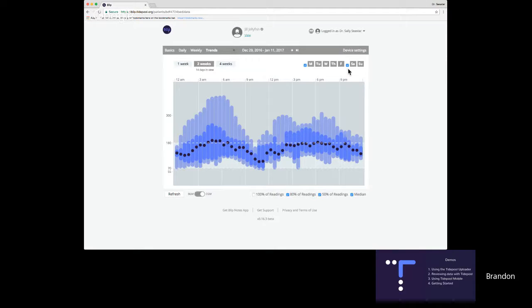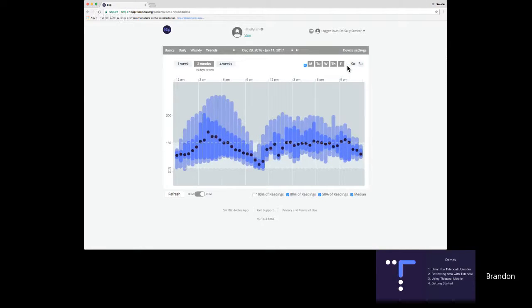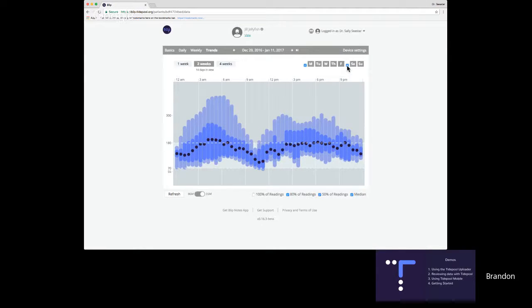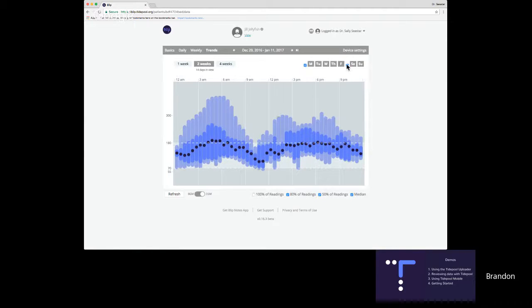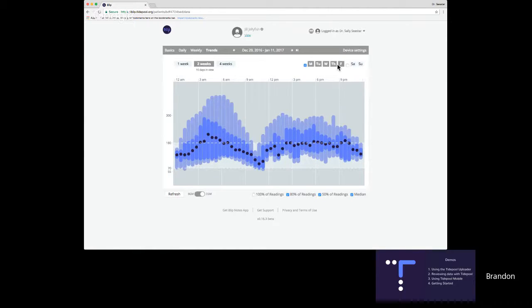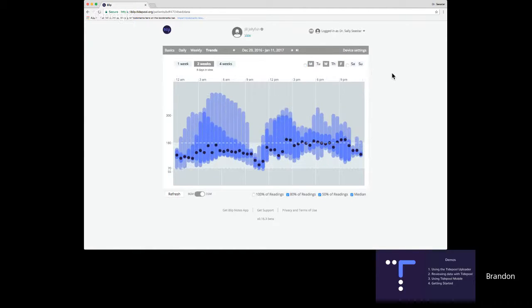You can also filter for specific days of the week — turn off weekends or weekdays. Or, if Jill has soccer practice on Monday, Wednesday, and Friday, you can just look at those days.